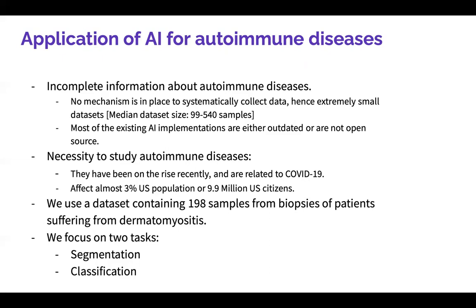In our study, we focus on a 198 sample data set collected from biopsies of patients suffering from dermatomyositis, which is basically an autoimmune disease. We focus on two tasks, segmentation as well as classification.